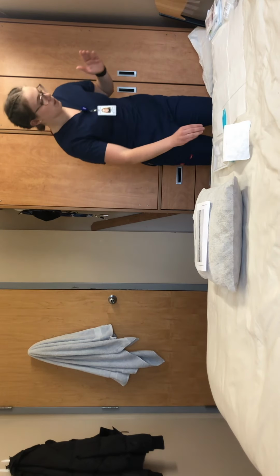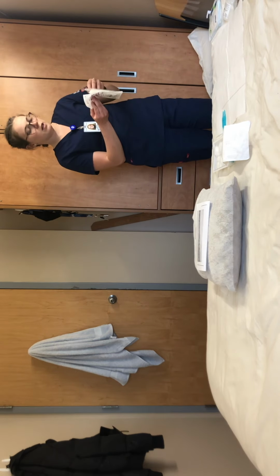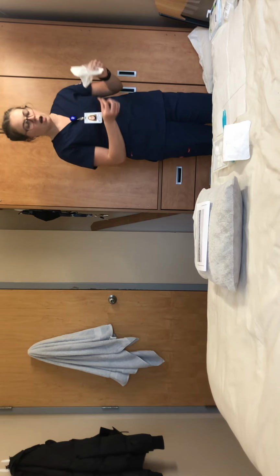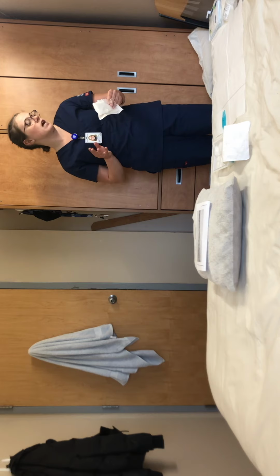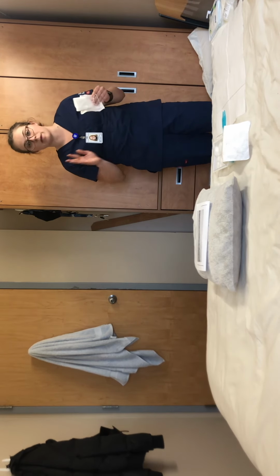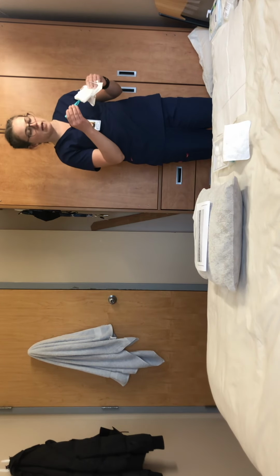So my abdominal pad, I will be opening that up, ensuring that I keep the sterile field. I will also be checking for the integrity of all of my supplies to see if there's any rips or tears, if there's any stains, and if all of the supplies that I have with me are in date. So then I'll be removing my abdominal pad from its packaging.